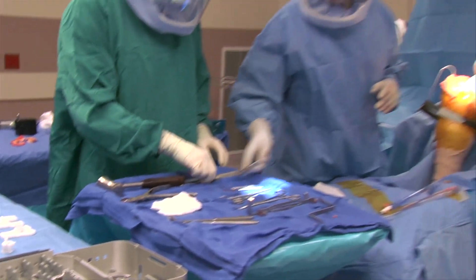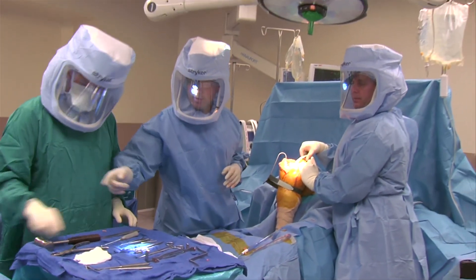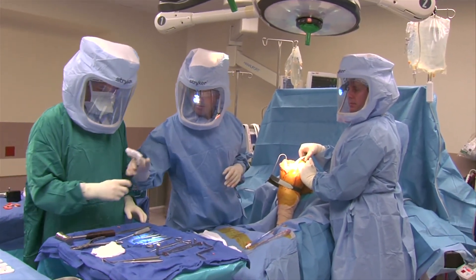As a surgeon, it's been very easy to transition to the Conformist model because even though it's custom for that patient, it is still traditional type of instrumentation that we would use. Normally when we're doing an off-the-shelf implant, we do the entire surgery of bone cuts to fit and position the implants into place — but that's only half of the surgery. Then we go through a whole other phase of balancing, doing dissection, doing different releases to the ligaments that allow it to be balanced.